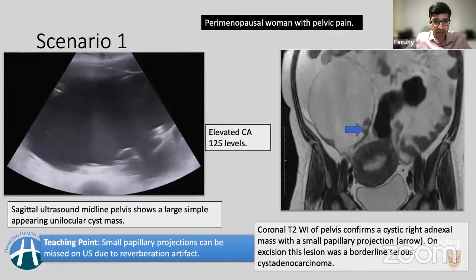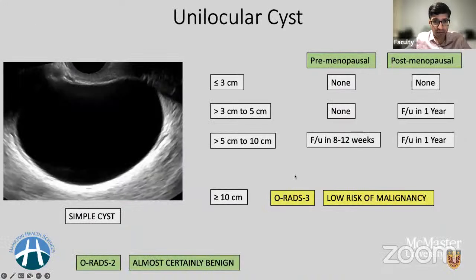And this brings us back to this important point, which is why the risk of malignancy suddenly changes when the lesion becomes larger in size. This may be one of the factors, as well as the size of the lesion.